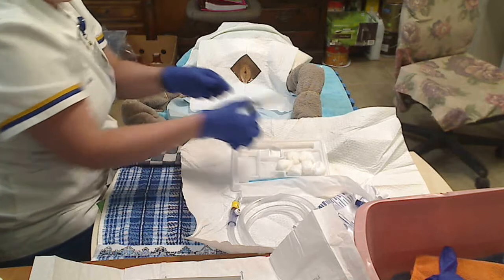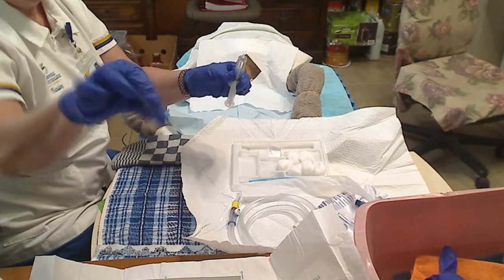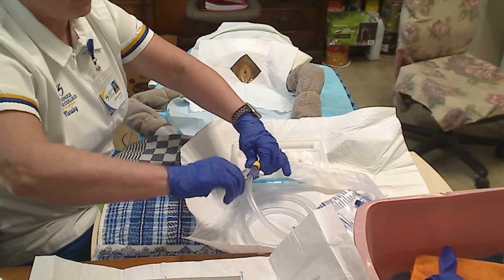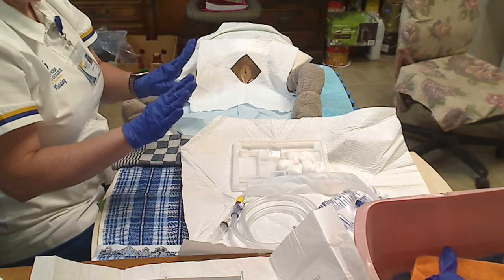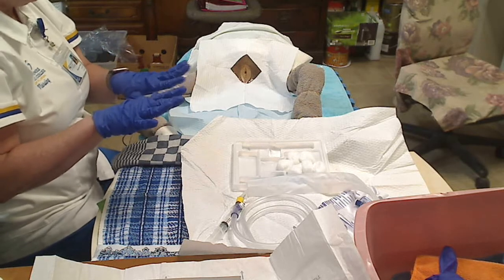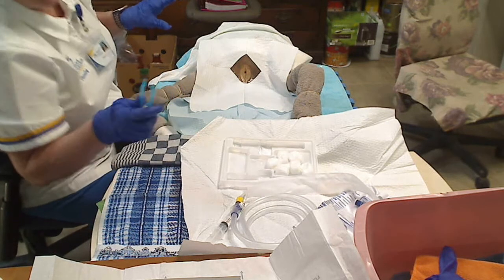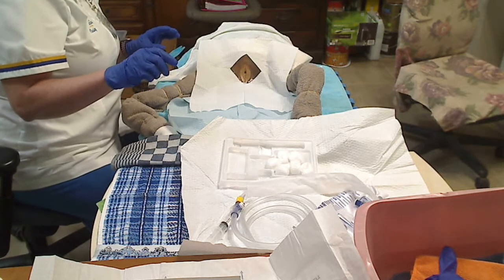I would go ahead and prepare my syringe. I will open the lid, drop it into the trash, and secure it properly to the injection port so that I can inflate the balloon. From here, I am now ready to go ahead and start my sterile procedure. So I'm going to slide over slightly. I am going to pull my forceps out and I'm going to begin to explain to Anna everything that I am doing. All right, Miss Anna, I'm getting ready to start my procedure.